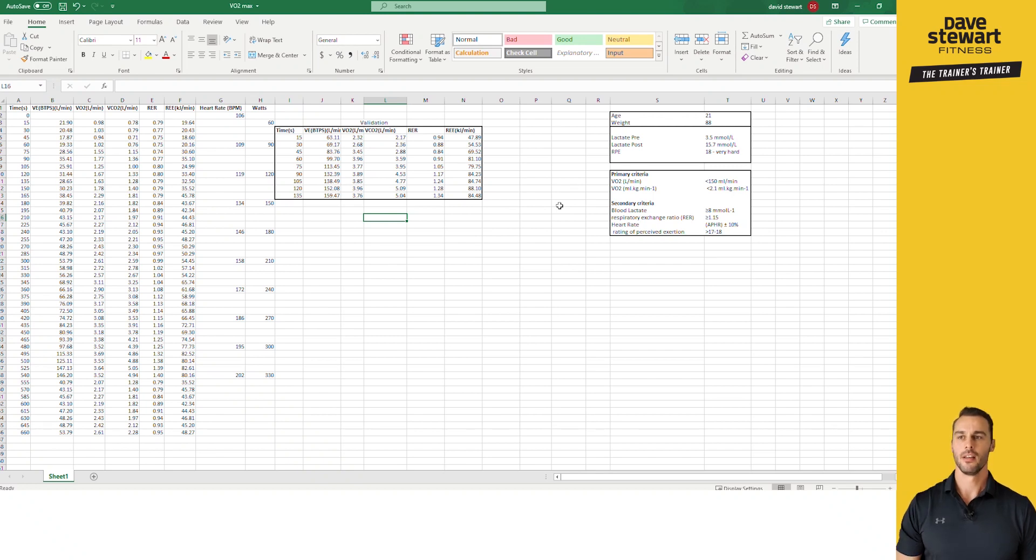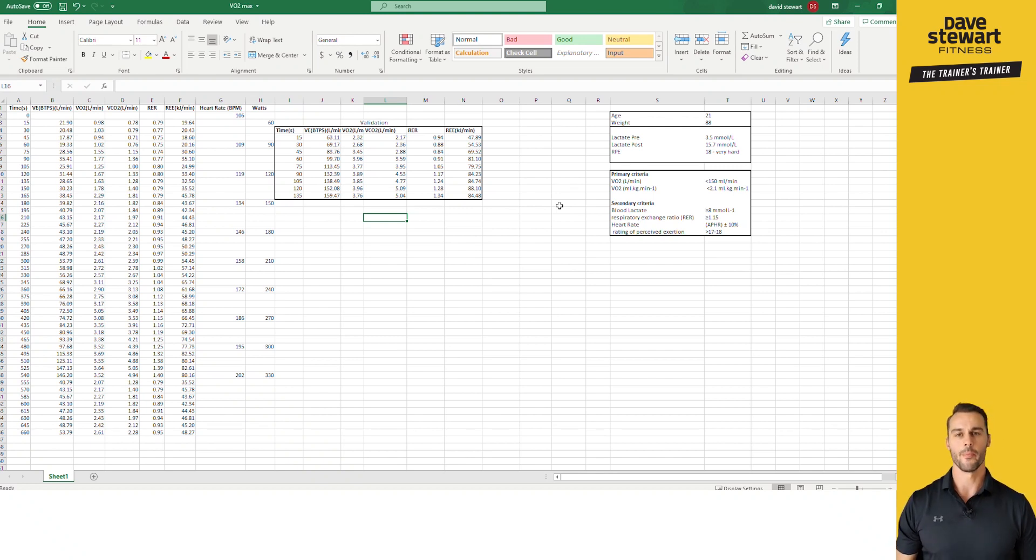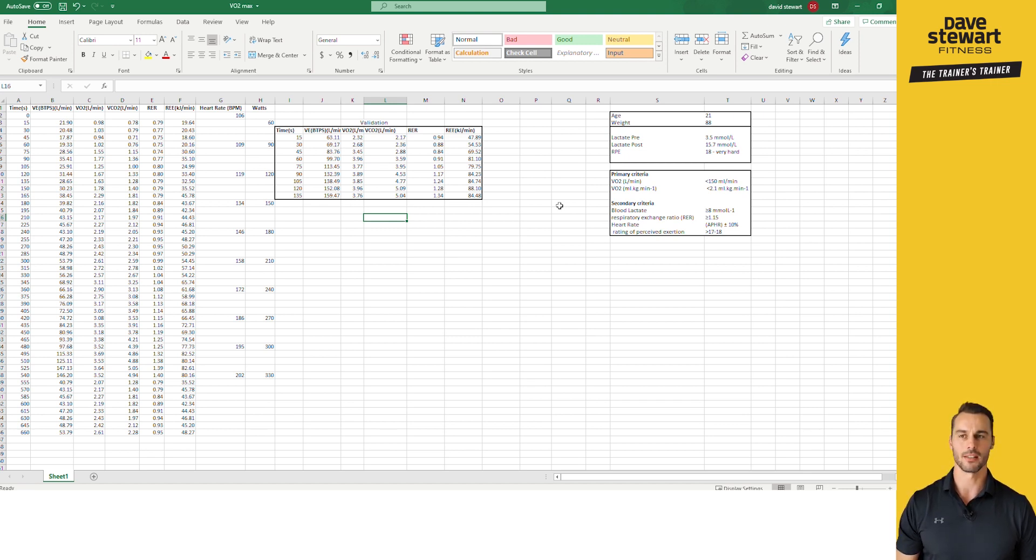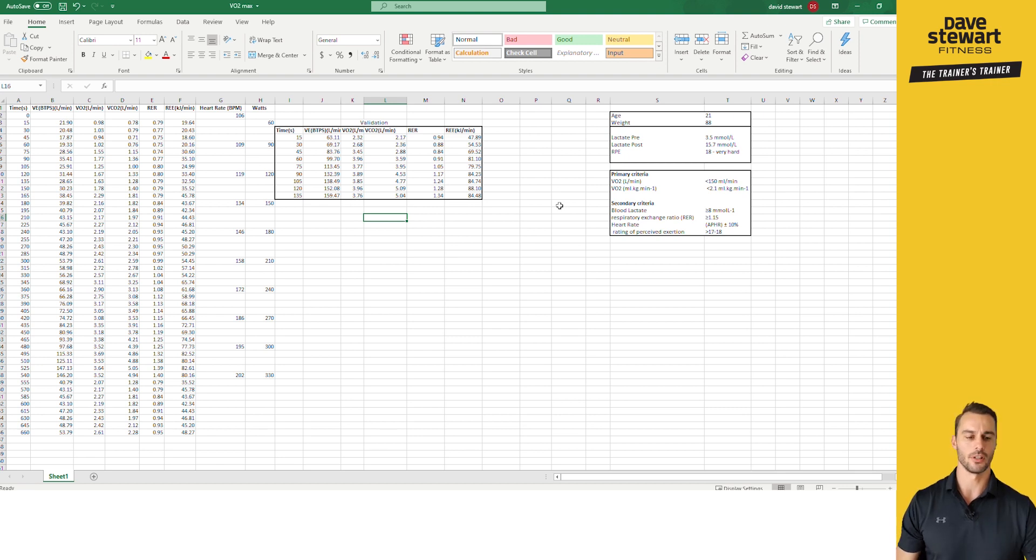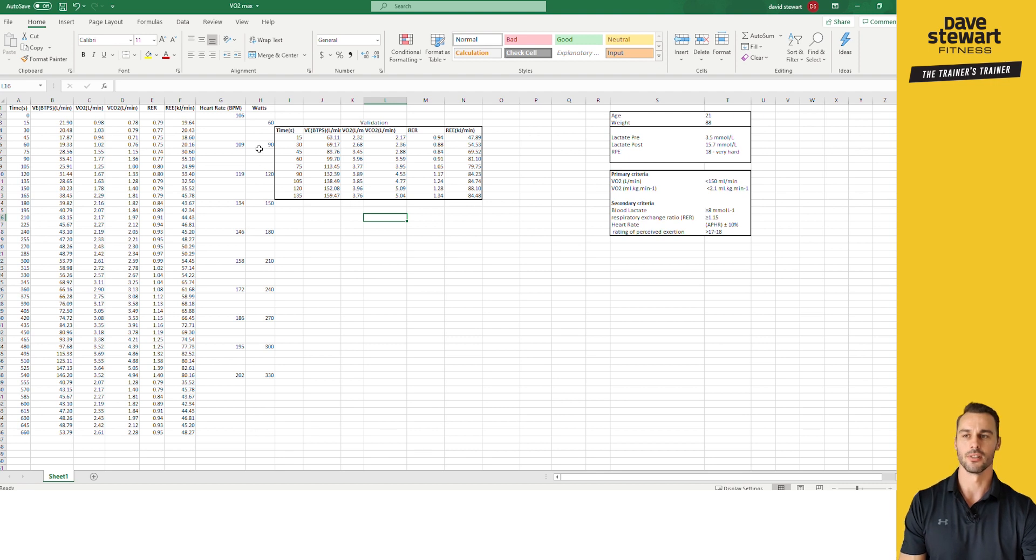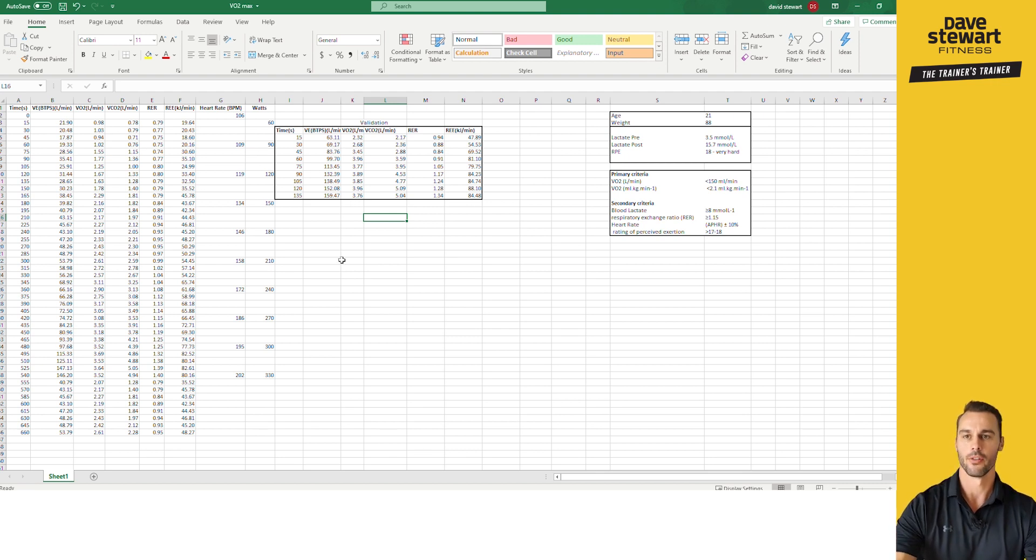Okay, hello guys, today I'm going to show you some basic data analysis of a VO2 max test. This max test was done on a cycle using a continuous protocol where we were increasing the resistance every one minute by 30 watts.